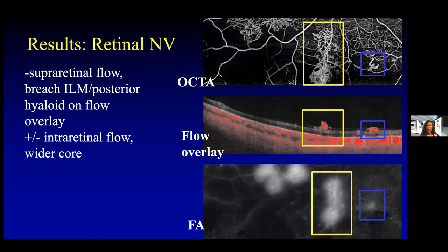What about retinal neovascularization? The features we noted were supraretinal flow that has breached the ILM and might even extend into the posterior hyaloid on flow overlay. Here on the upper right, the OCTA in the yellow square shows retinal neovascularization, as well as the blue square. On the flow overlay, the flow has breached the ILM, and the fluorescein angiogram below corresponds to retinal neovascularization.